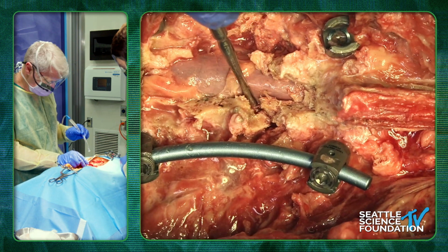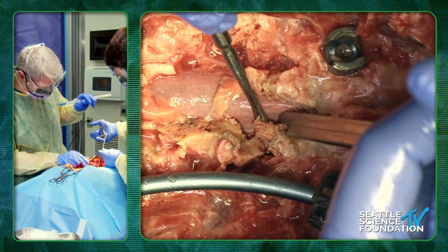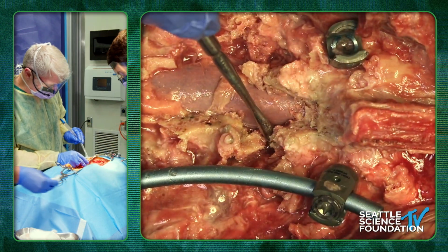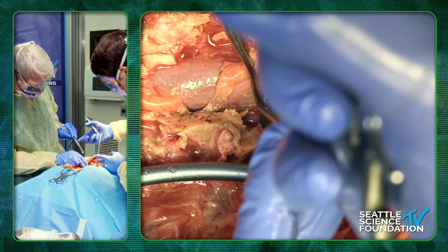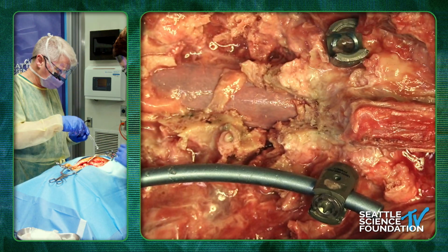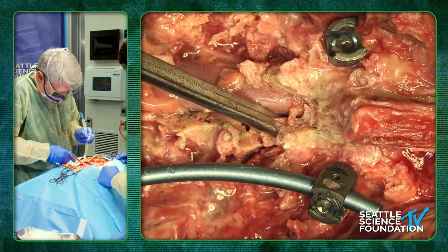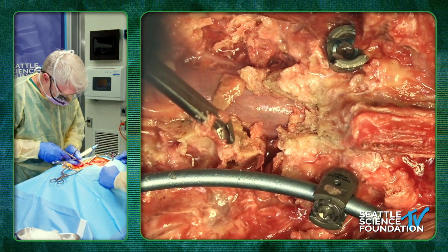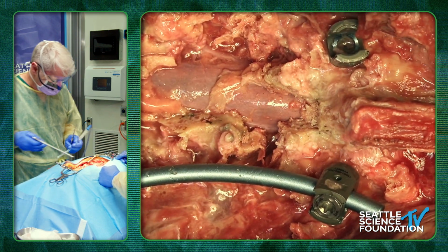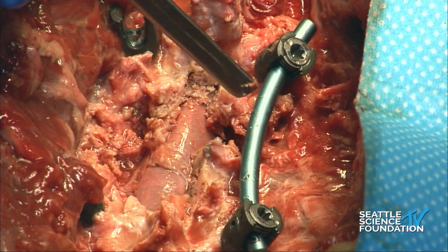So here, take a Kerrison. And just take the rest of the ligamentum flavum. Not the bone, just the ligament, and just cut underneath. Perfect. There's still a little more ligament, so you want to get all that out. So it's kind of a decompression of that joint. Perfect, just undercut a little bit more. Okay, so this will free up this side over here. So now we have the Smith-Petersen finished on this side. That's all I really need to do. Thanks. And that'll be our release on this side.